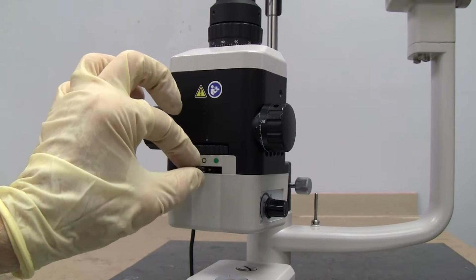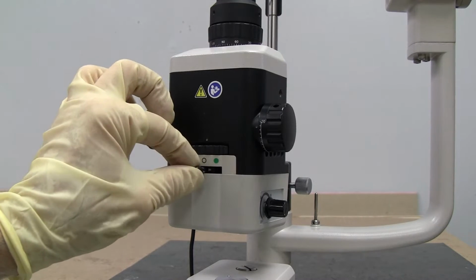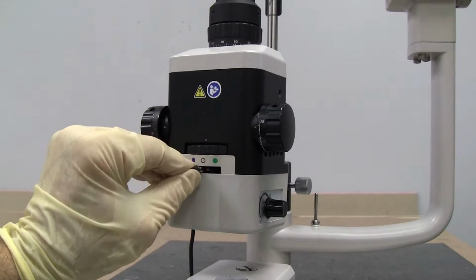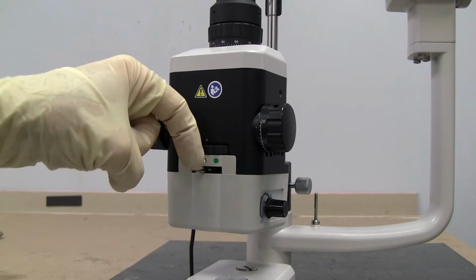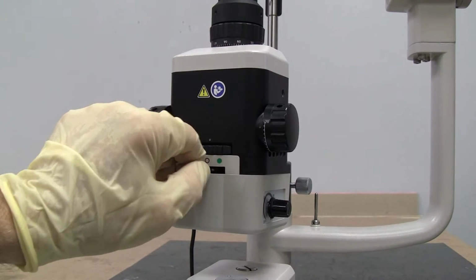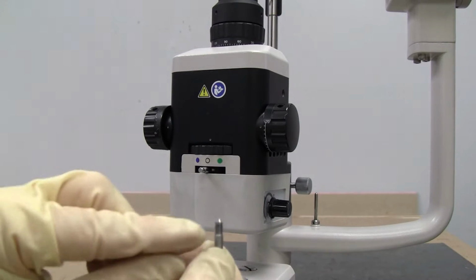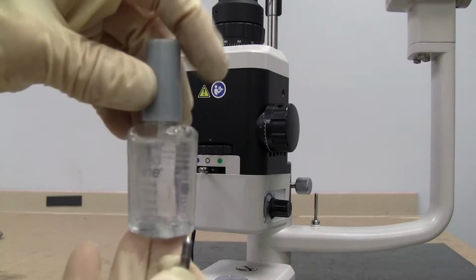So if you still have the cap on there, you can take it off. And if you don't have something to fit in there, you may have to just use some pliers to loosen it. And what we're going to do, we're going to take it all the way out to put something on these threads.